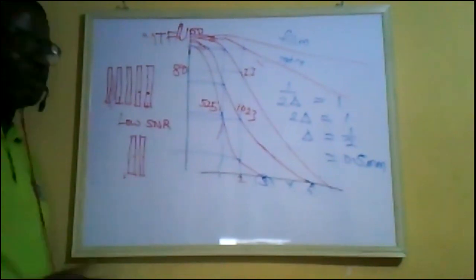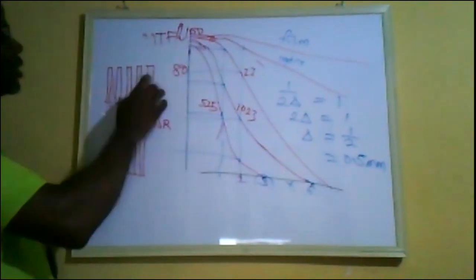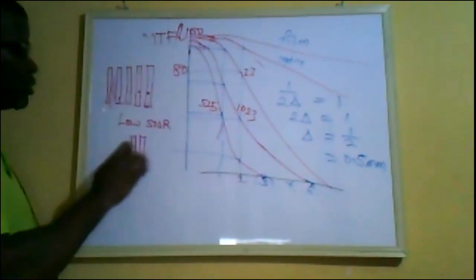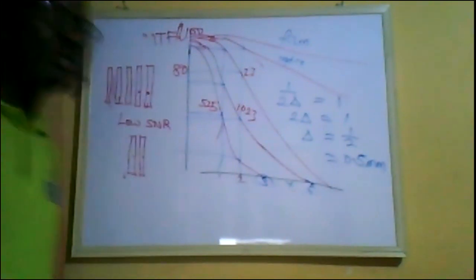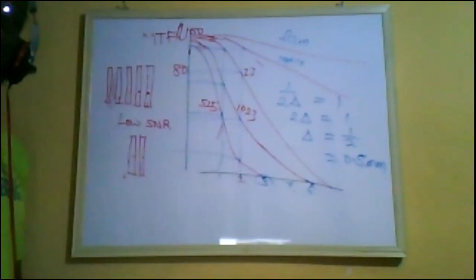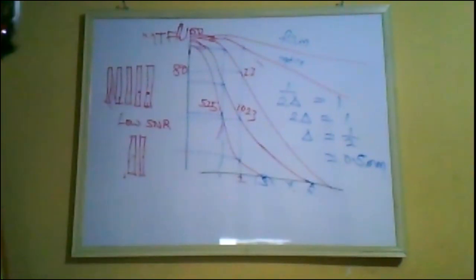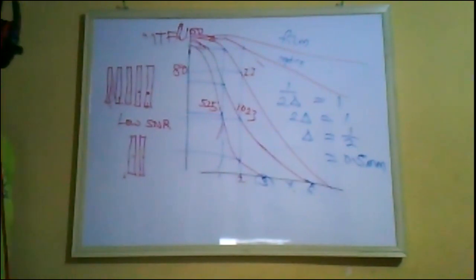As you are looking, you'll have a kind of lag because the image that has been used is actually the combination of so many images. It's just the average of so many images. So at the end of the day, you're going to see that as a kind of lag. I don't know whether you got that. Yes, I do.